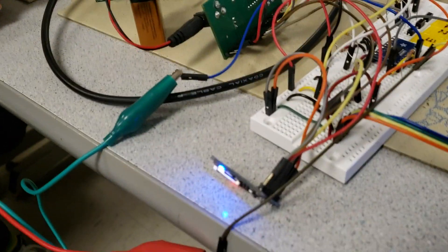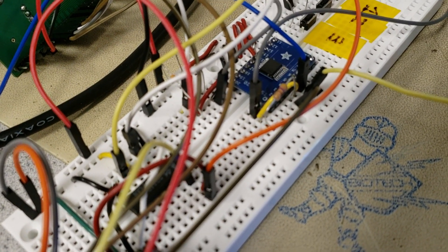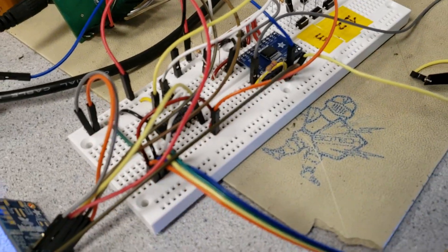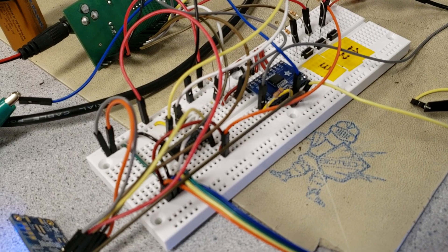And finally, the impedance analyzer, which is responsible for correlating a body's impedance with hydration. And even though it's on an Adafruit board, that's not an Adafruit part — that's Analog Devices. The AD-5933, a wide bandwidth impedance analyzer.